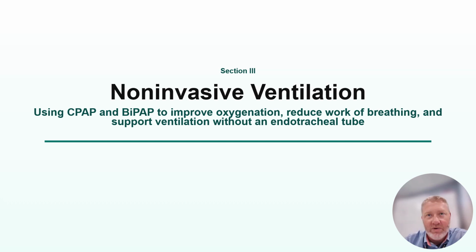So if you need to add PEEP because they're acidotic, if you get a blood gas and they're compromised with their ventilation, or if they're CHF and they've got a lot of fluid on the lungs or pulmonary edema, anything that needs positive pressure, high flow nasal cannula is not considered a direct positive pressure device.